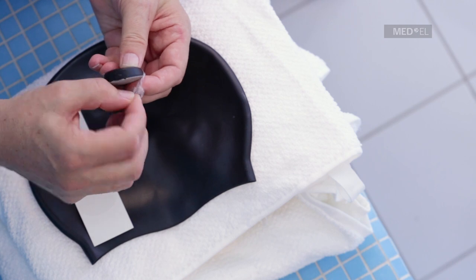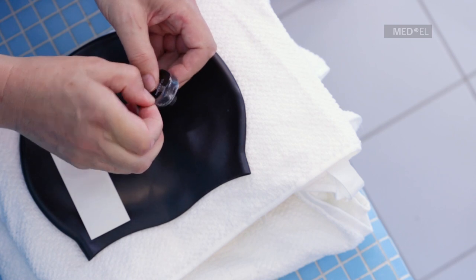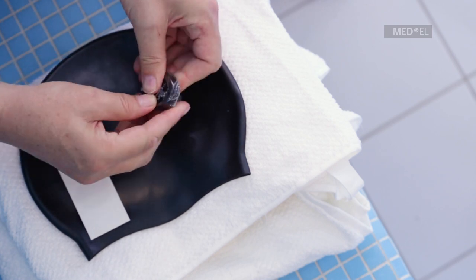Take the flap at the bottom and pull the rest of the cover over the processor. Make sure the cover fits snugly around the processor without any wrinkles or air bubbles.